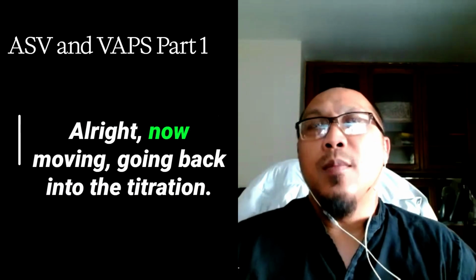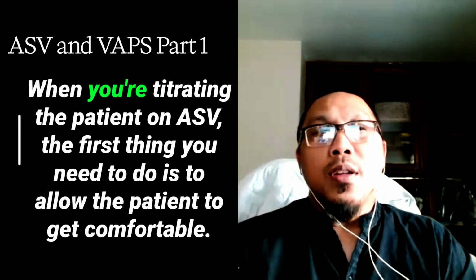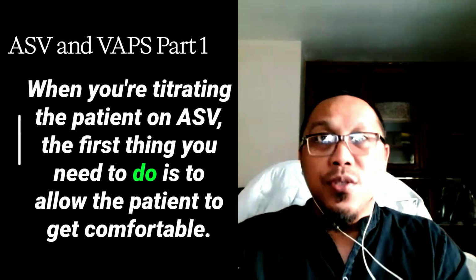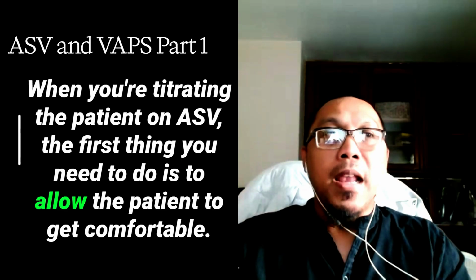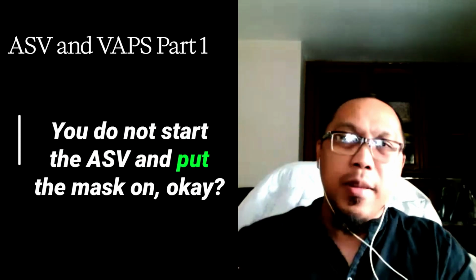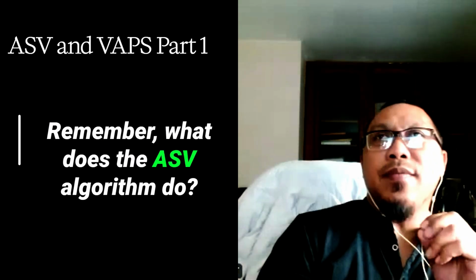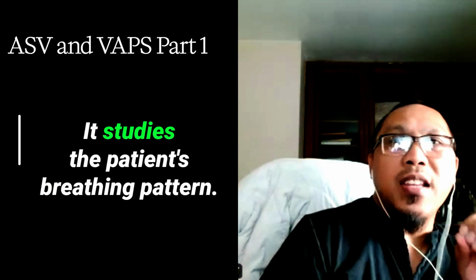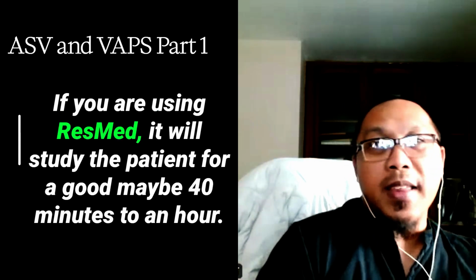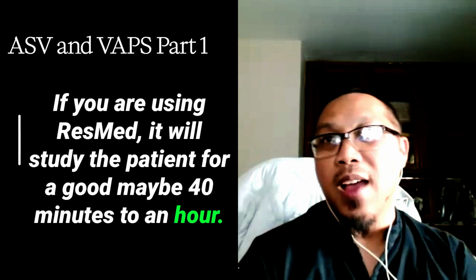All right. Now going back into the titration. When you're titrating the patient on ASV, the first thing you need to do is to allow the patient to get comfortable. You do not start the ASV and put the mask on. Okay. Remember, what does the ASV algorithm do? It studies the patient's breathing pattern. If you're using ResMed, it will study the patient for a good maybe 40 minutes to an hour.